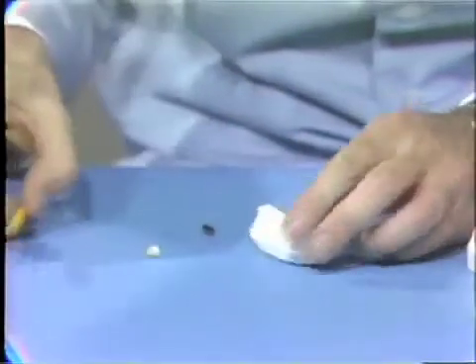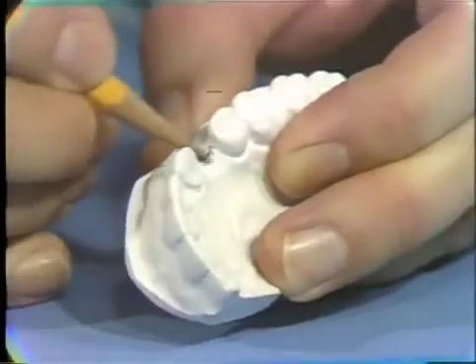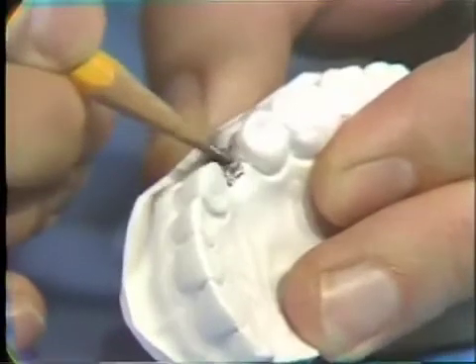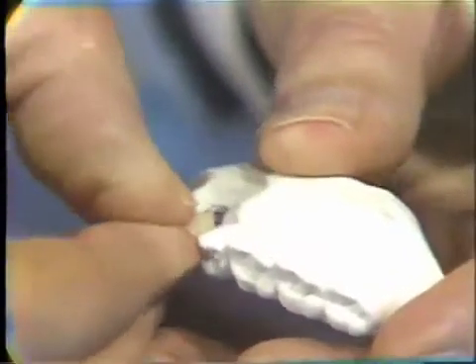So the thing to do then is to take this duplicate model and mark the alveolar area with a lead pencil. Rub it on to get a good covering of the graphite from the pencil, and then place the pontic in position, press it down onto that surface, and then remove it.